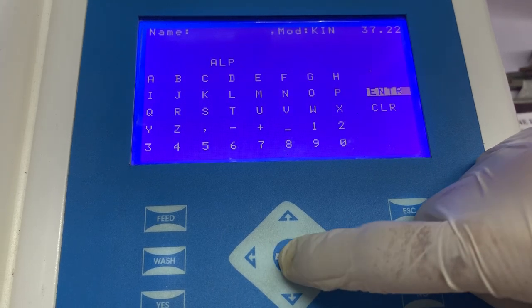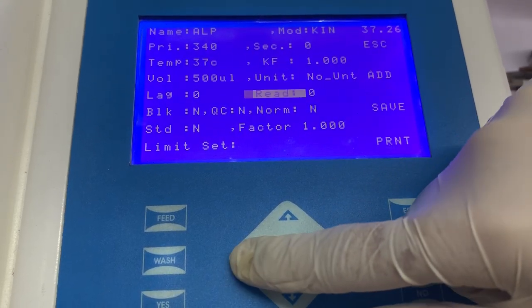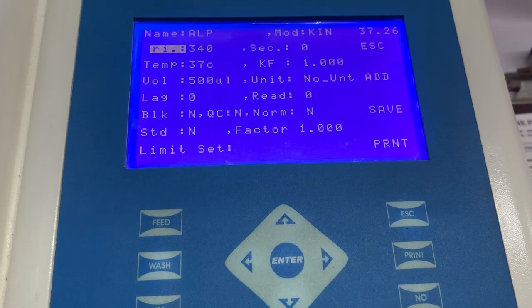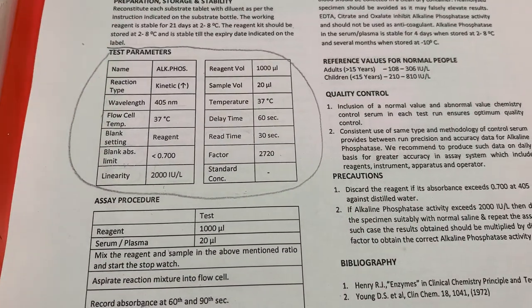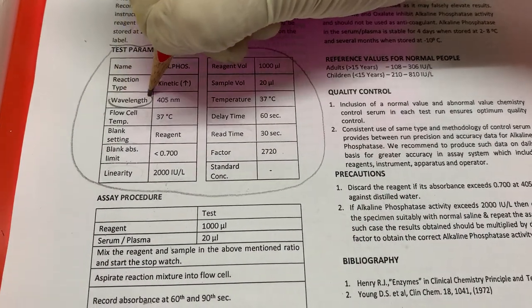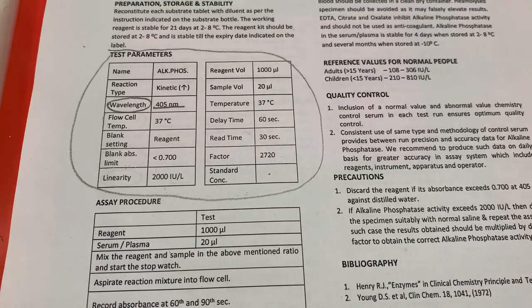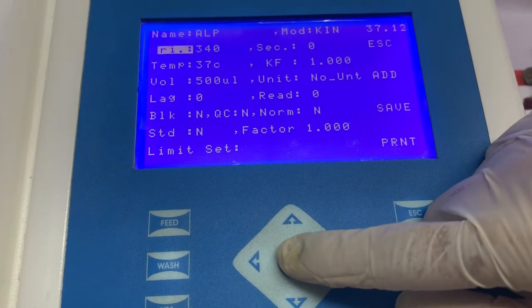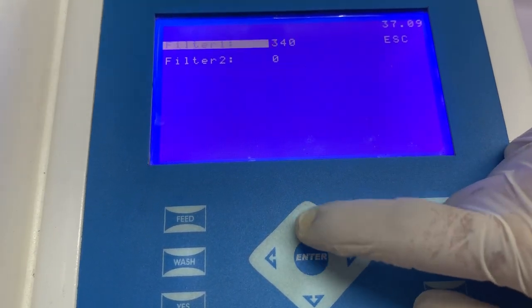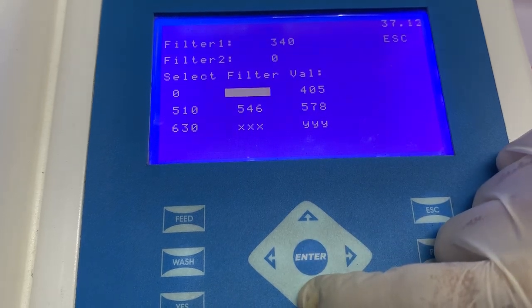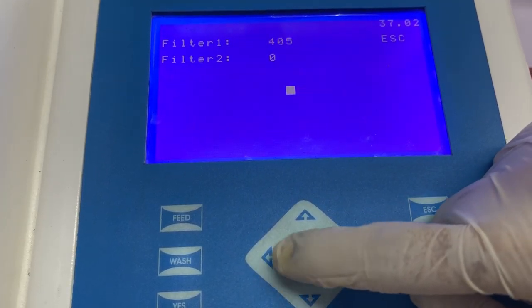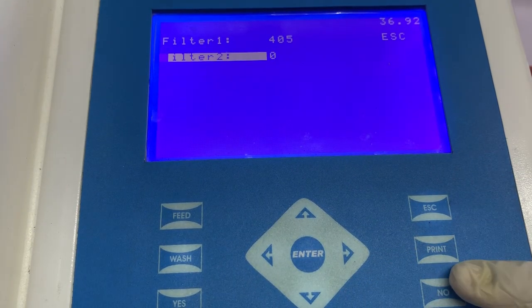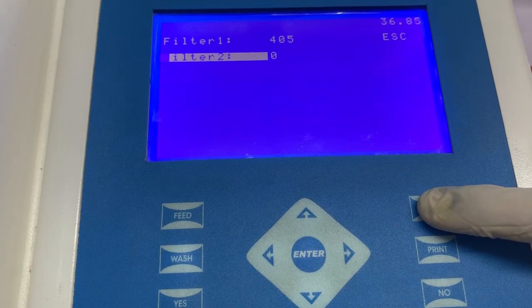Once you have entered the name, select enter and come back to the home screen. The next information that needs to be entered is primary wavelength. The information about primary wavelength can be seen in the instructions for use, where the manufacturer clearly mentions at what wavelength the absorbance needs to be taken. Select the option of primary wavelength, then select filter 1, and from the list choose the wavelength mentioned in the instructions for use. Because the manufacturer has not given any information about secondary wavelength or filter number 2, we will leave this option blank.